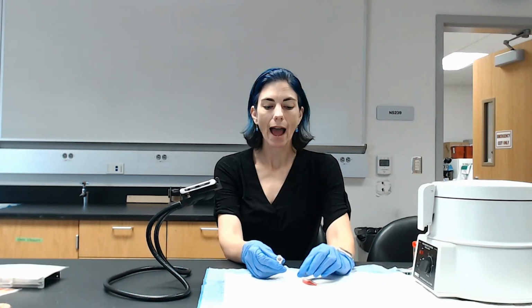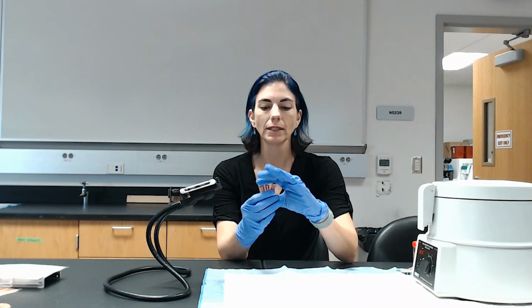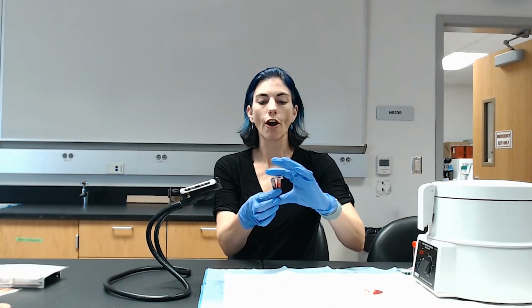So in this lab, there are actually 3 different blood samples. There's sheep's blood, so it's not typical human blood. But I have a sample, this is sample A right here. I have a sample that is considered to be normal. And then I have 2 samples that are anemic. So remember, anemic samples mean that they're not going to have enough hemoglobin in them.